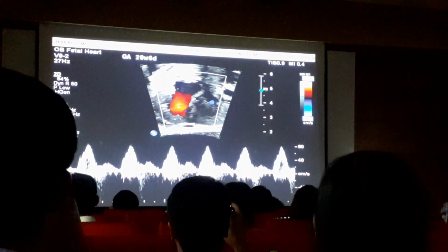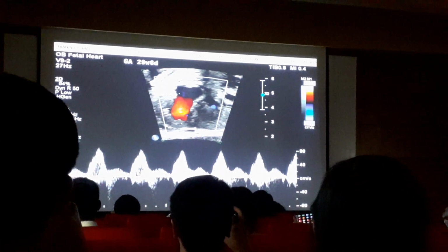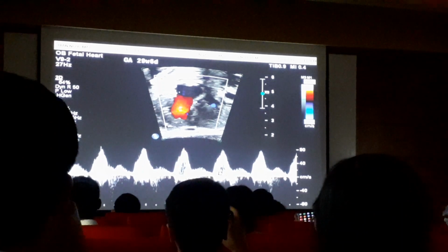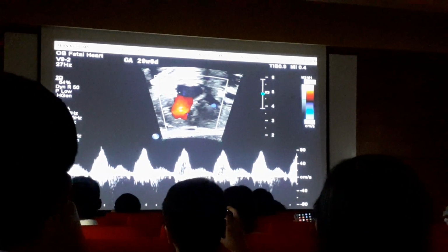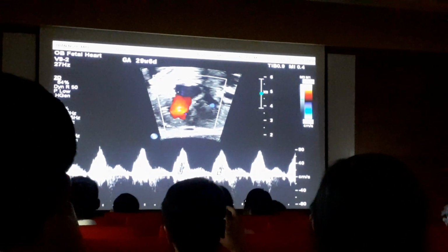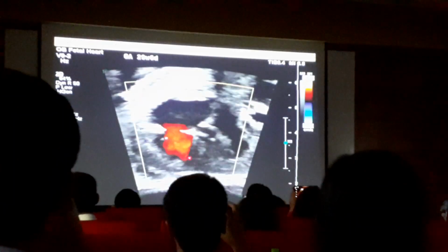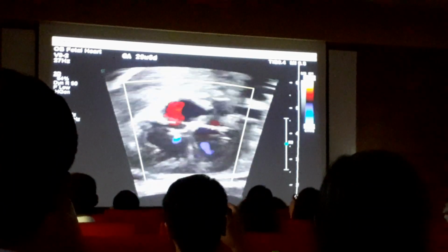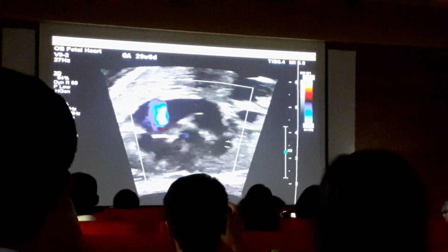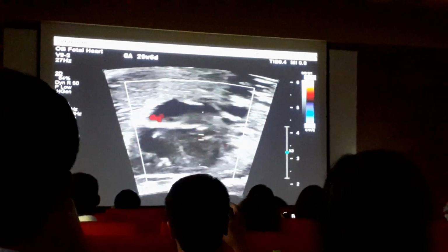And we're seeing clearly monophasic inflow. It looks like it has only one phase. Going along with the hypertrophy and some degree of diastolic dysfunction, we can combine this image with the 2D image of the right ventricle, which suggests we suspect reduced diastolic function of the right ventricle. Let's look at the mitral.